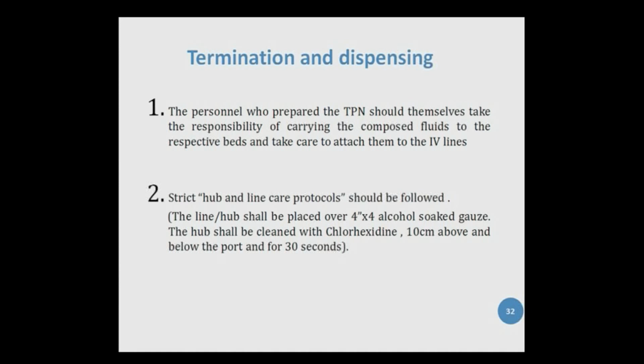Once it is attached, the person who has prepared the TPN should take the responsibility of carrying the composed fluids to the respective beds and take care to attach them to the IV lines.